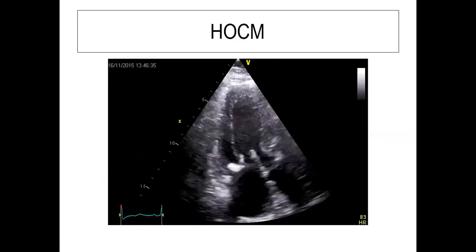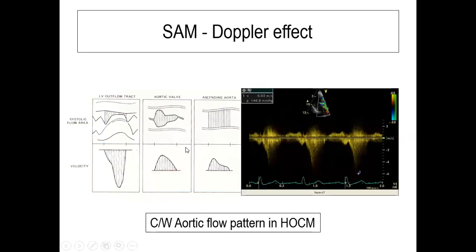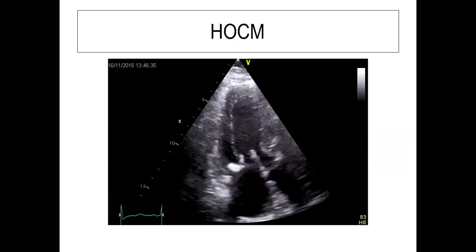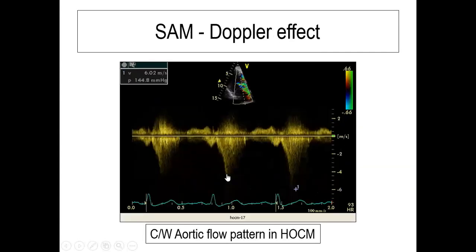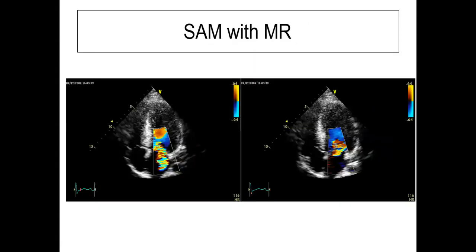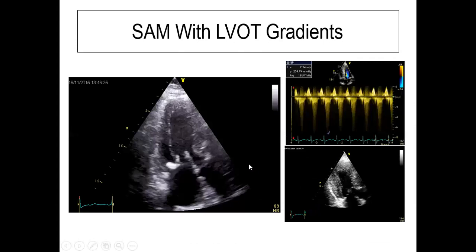So let me show the slides one by one. Sorry, somehow they are not playing. So that's how you look at the systole, and you have that MR.